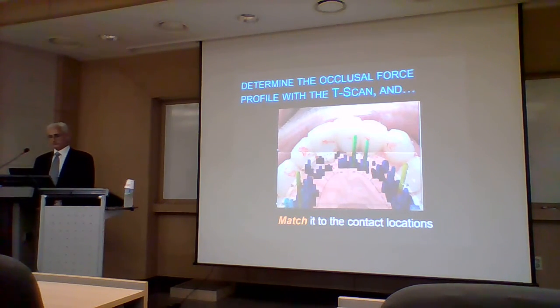뭔가 이제 주관적으로 감각적으로 한다는 건 굉장히 정확할 것 같지만은 에러가 많은 거죠. 티스캔 찍어가지고 맵핑을 해가지고 우리가 손을 봐야 될 컨택이 어딘지를 명확하게 볼 수 있는 게 유용성일 거고. And you can see in this case, if you went by ink size, you would not treat these two contacts. You'd be treating other contacts which aren't actually high force. 그러니까 저거 갖다가 사이즈만 가지고 한다고 생각하면 정작 제거해야 될 부분을 남기고 나머지 부분을 제거하게 되겠죠.